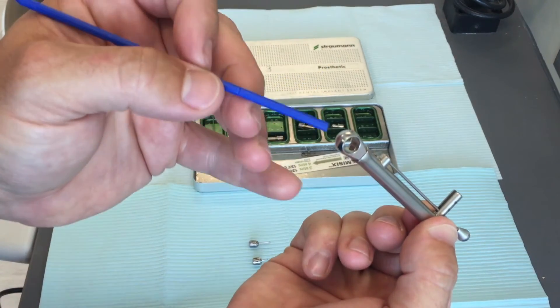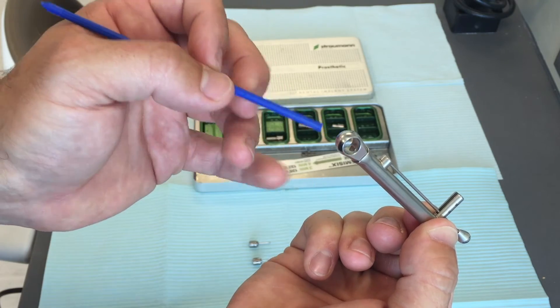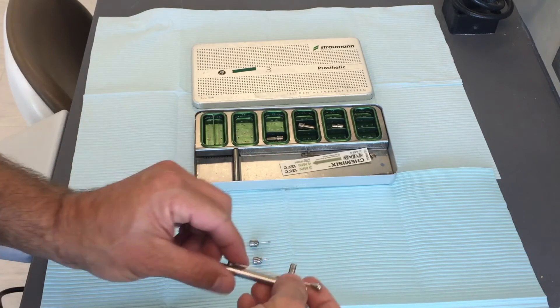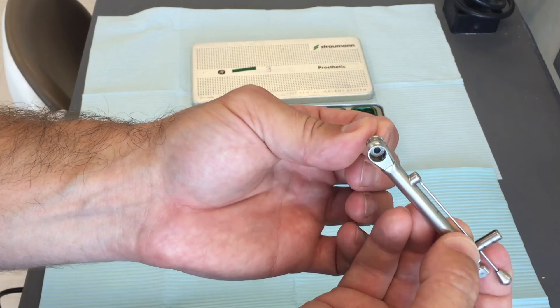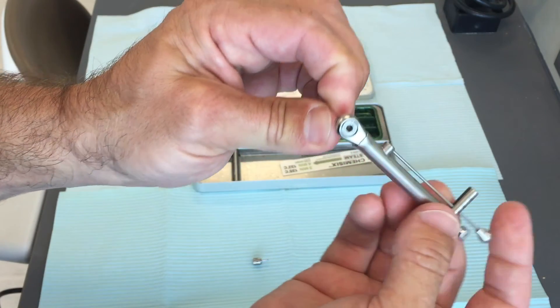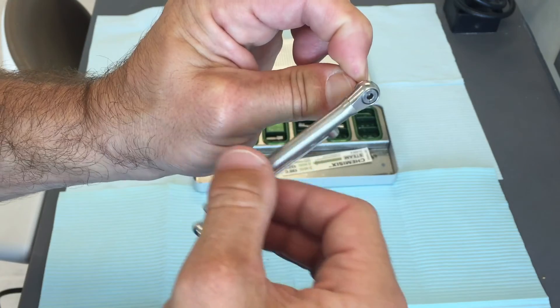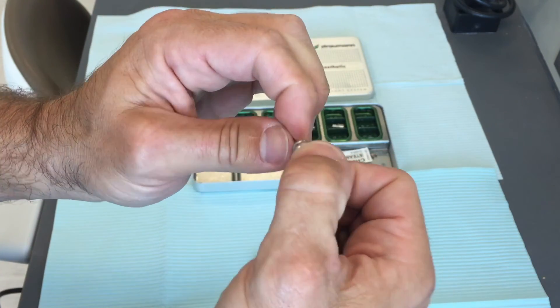On the ratchet end, you should see a little knob sticking out. This needs to be sticking out because if it doesn't, you won't be able to engage the driver and you won't be able to tighten the screw on your prosthesis. That's the assembly and proper use of a Straumann torque wrench for placing your implant.